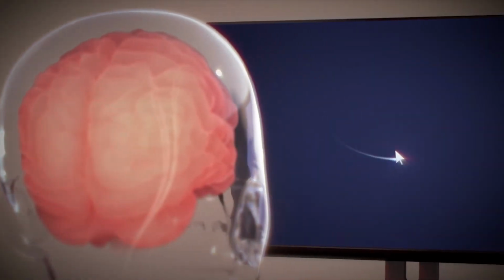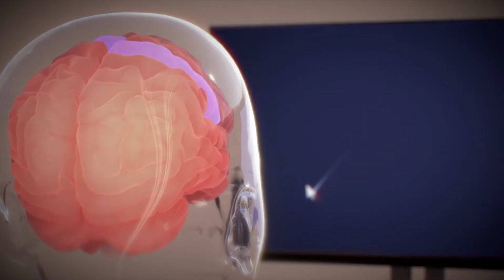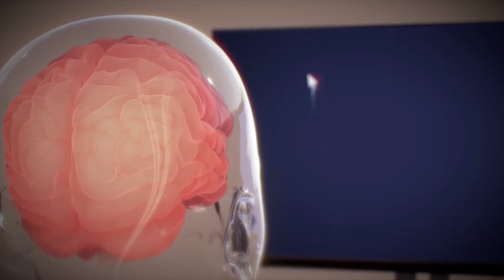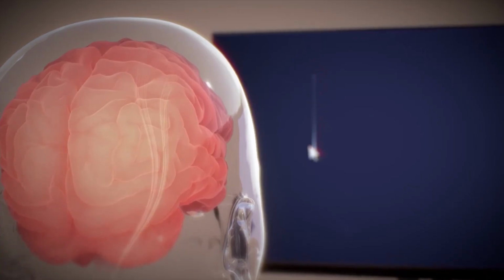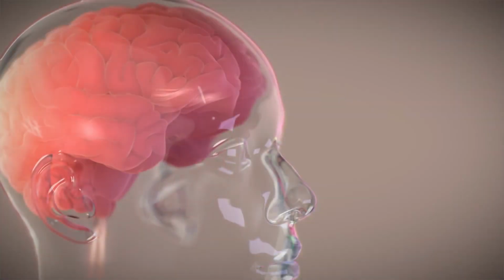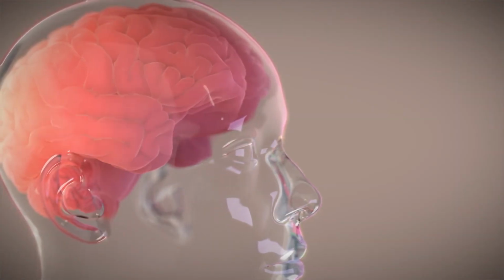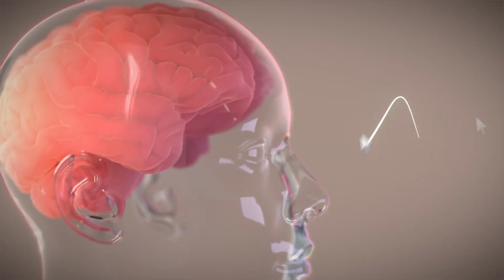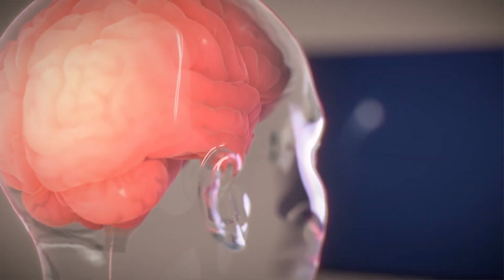Information about moving your cursor can be found in a number of brain areas, including the primary motor cortex, or M1. When the cursor is moved up, some neurons in M1 will fire a lot, some will fire a little, and others will be silent, and vice versa if the cursor is moved down. In other brain areas, relevant information is represented in more complex ways, which can be learned with more sophisticated models. Through these relationships, we can begin to decode the communication signals in the brain. And by recording enough neurons, movement intent can be elucidated with higher fidelity.